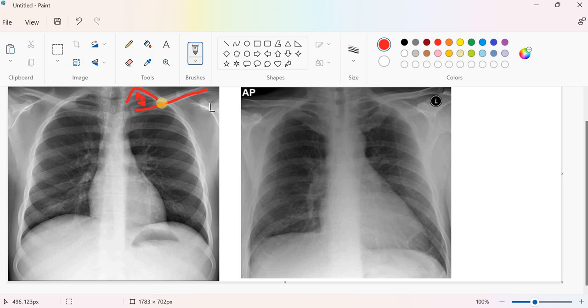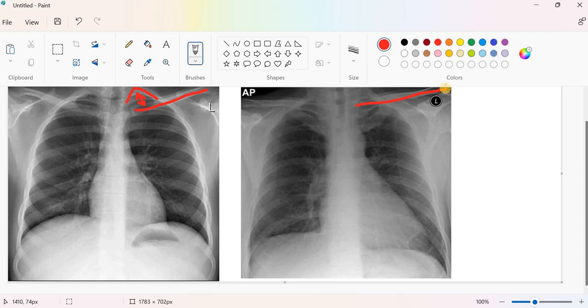Well, if we look to the anteroposterior view, you will find that the position of clavicle coincides with the position of the lung apex. There is no big distance between both of them.